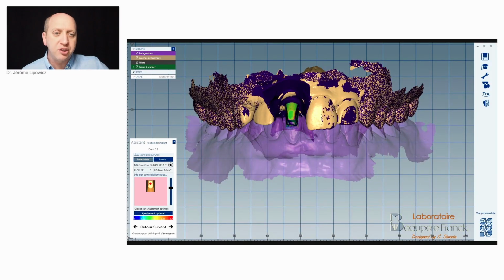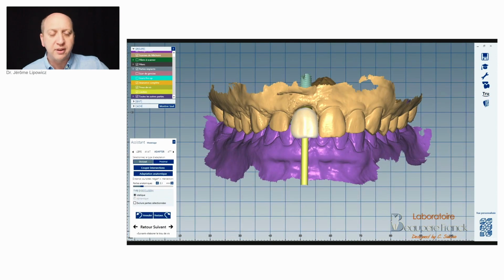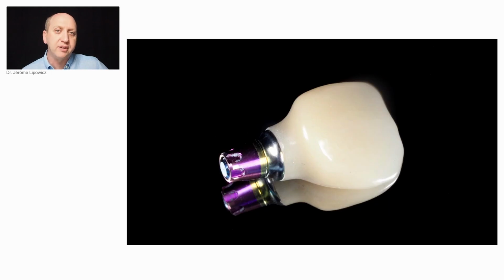And then the dental technician gets the file, the STL, right after surgery by email. And he can just edit and correct the final position of the abutments because of the new implant position, and then he can mill it. So in less than 3 hours, I get delivered that PMMA bonded on a Ti-base abutment.